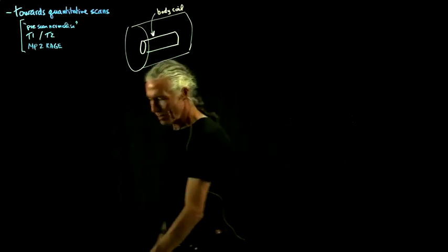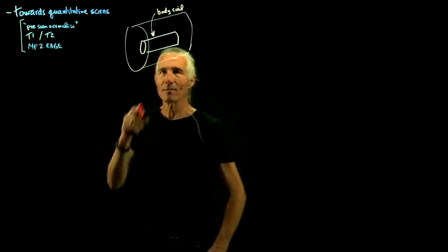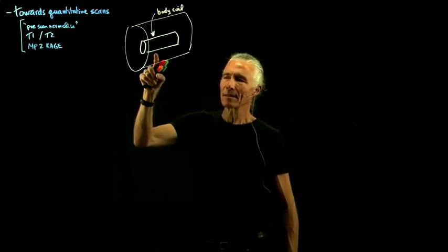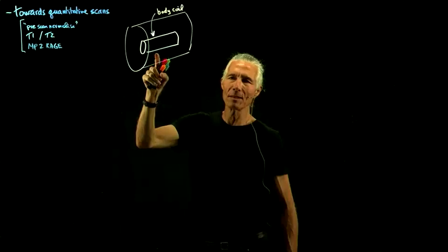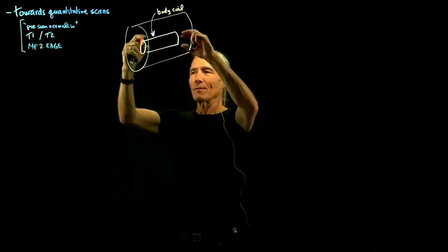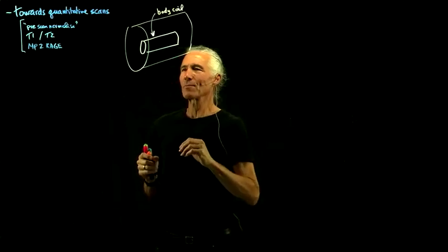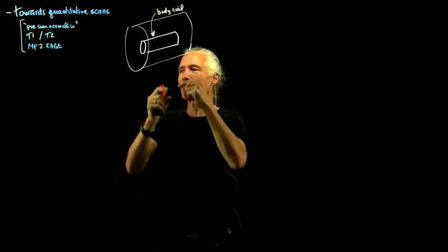But you can also receive from the body coil. There's no reason you can't. You don't generally do that nowadays because the signal to noise isn't as good. And why is the signal to noise bad? It's not because the body coil is a bad receiver. It's a great receiver, actually a much better radio wave receiver than the small coils. It's a big antenna. The problem is it's picking up all the junk from the whole rest of the room, and your kneecap and everything, and you're trying to record from the brain.